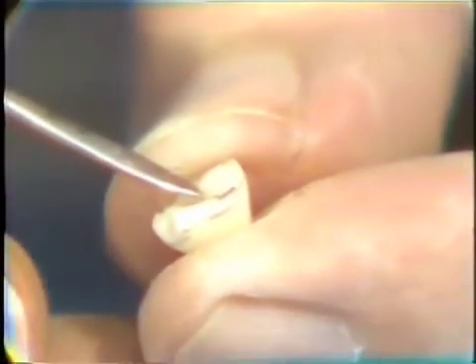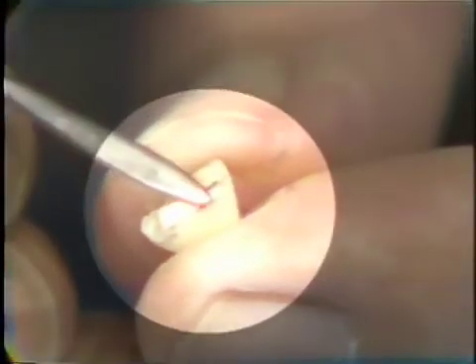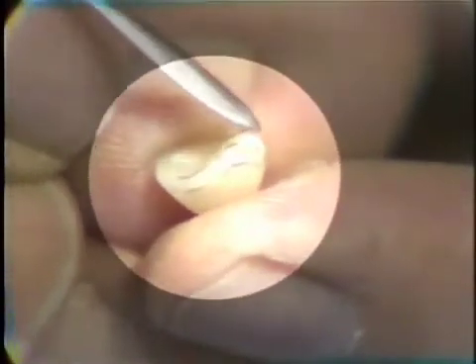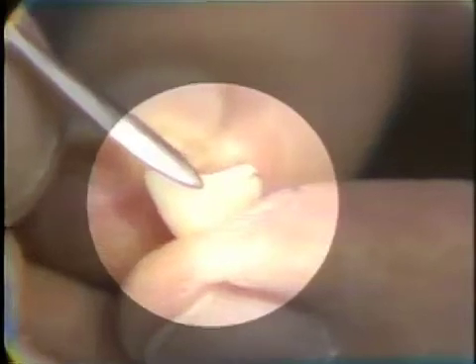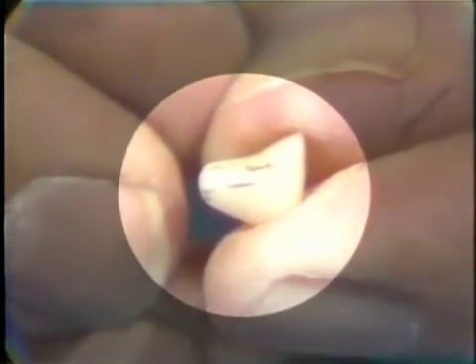This is the occlusal surface here, you see, and here is our bevel coming down on the proximal. So the gold is going to overlap there from the occlusal surface. And it runs round here, and notice it dips down and covers over that keyway there, then comes up onto the other proximal along here and blends together with the occlusal there. So this gives a little shelf of gold that runs around from mesial across the lingual there and onto the other proximal there. So this is just a modification to the pontic.